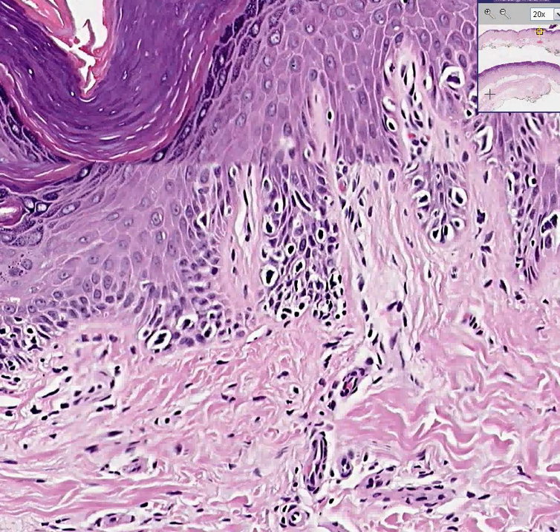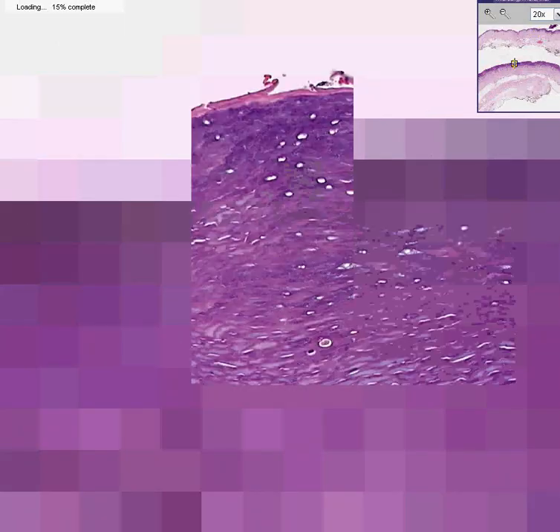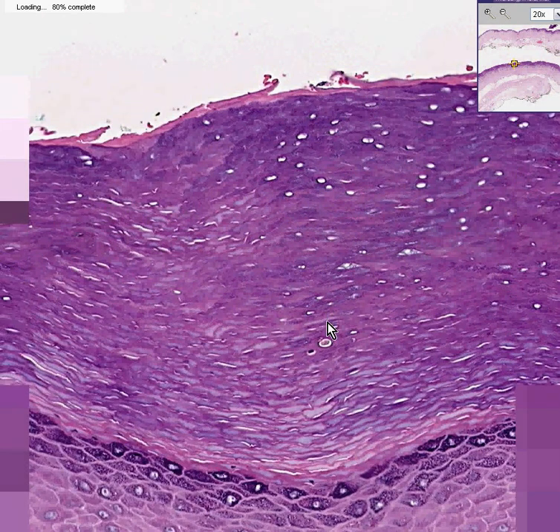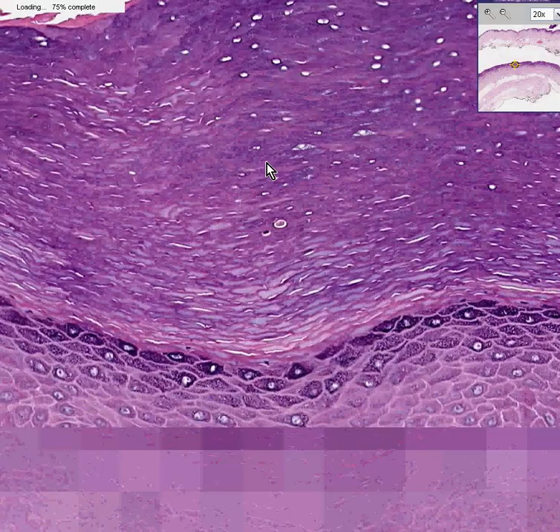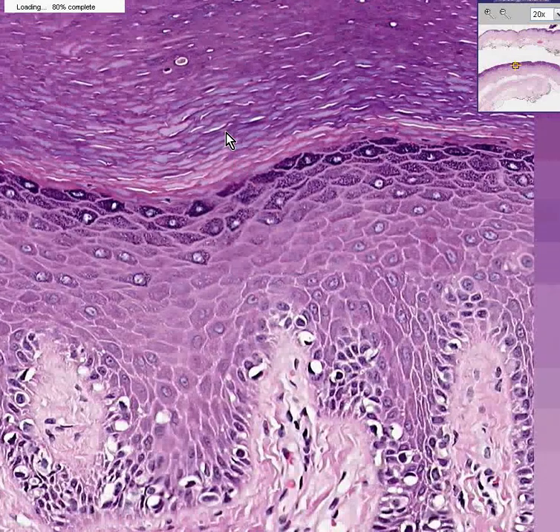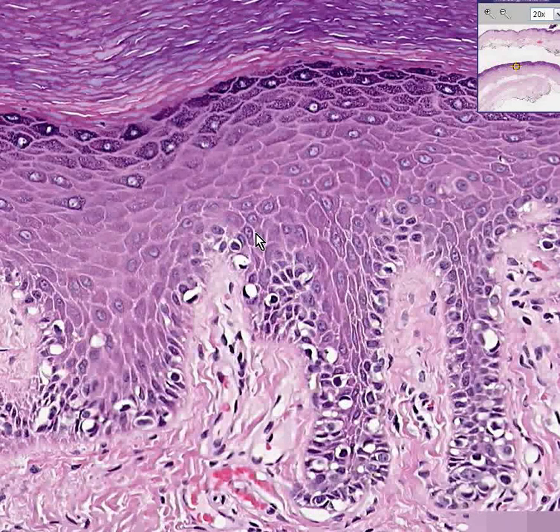If you notice in the upper skin section here, we're looking at some increase in melanocytes. Let's go to the worse part. Let's go to the lower section. And you could see a thickened stratum corneum here. It's hyperkeratotic. Perhaps it's thick skin. Perhaps this was the sole or a finger. Notice we have even more proliferated melanocytes. And in addition to that, some may very well look atypical, like here, like here. Perhaps they're a little bit bigger and darker than they should be.